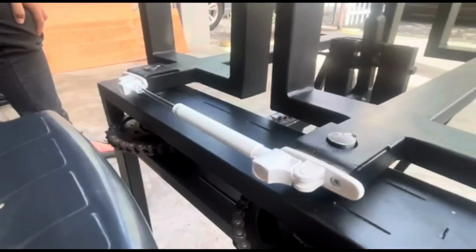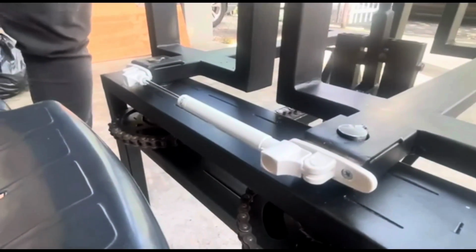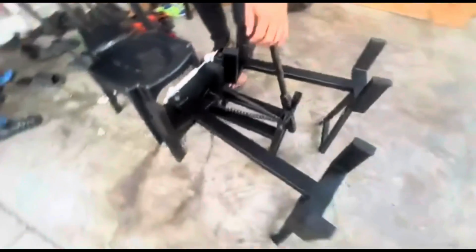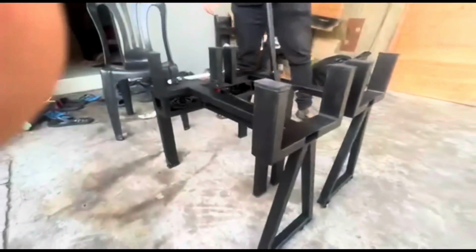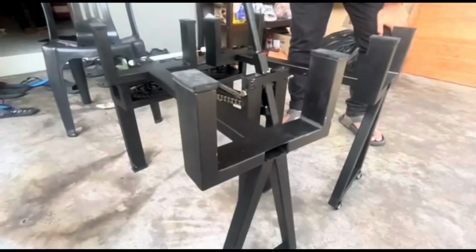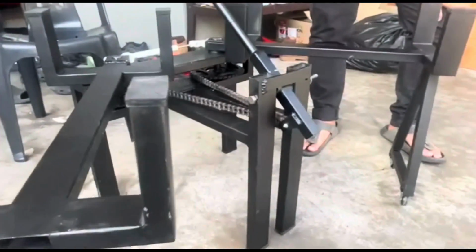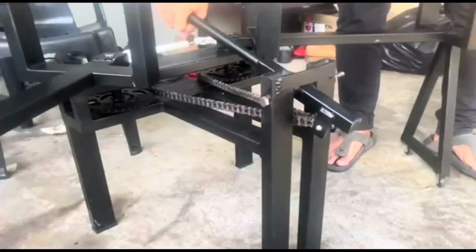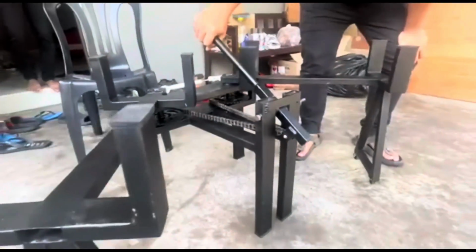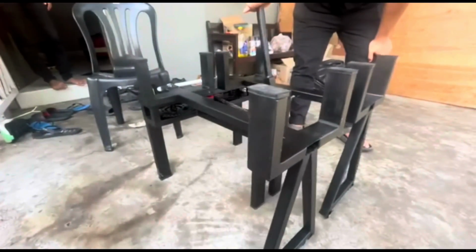Right, the overall mechanism of this device is that the patient applies force to the handle, and then to the double chain. From the double chain to the big sprocket, and then the sprocket applies energy through the shaft to the leg pad to make the leg pad open, and then the damper is used to close it back. Other than that, we have used 4 wheels to make the leg pad move smoothly.